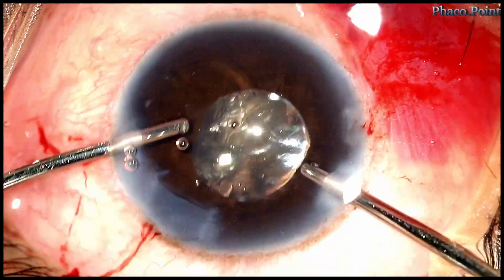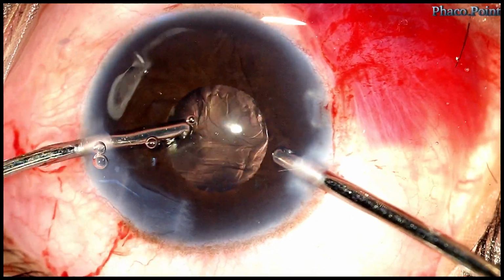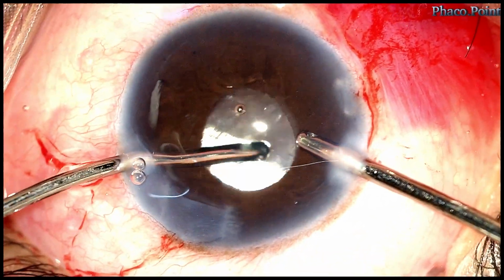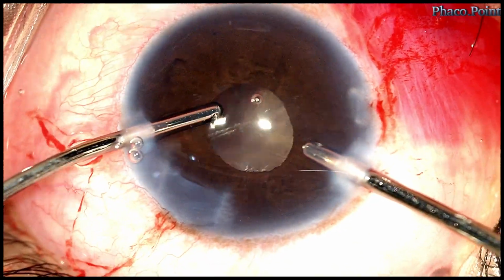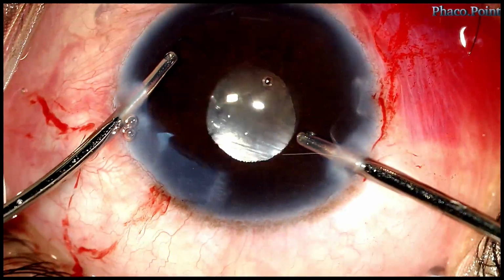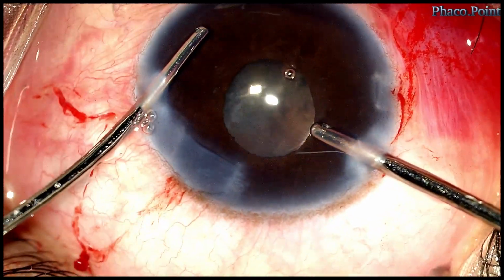Following the completion of the IOL implantation, the excess viscoelastic is washed out from the anterior chamber. We have to ascertain that we do not have any major rocking and rolling movement of the IOL, because that could disturb the vitreous once more, and that is something we'd like to avoid.